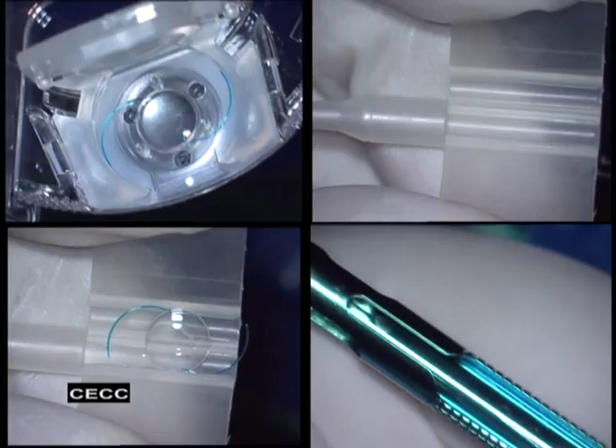Many of my young friends have expressed discomfort with handling this IOL, especially the injector system in the case of Sensor IOL Emerald Unfolder Series. A few of us who have been eye surgeons for a longer duration, having handled the precursors and silver series, fortunately have no issues with this device. In this film, we will demonstrate implantation of Sensor 3-piece hydrophobic acrylic IOLs using the Emerald Unfolder System.